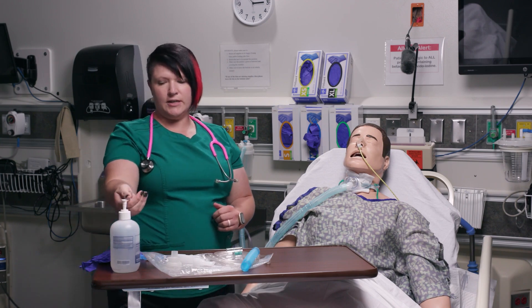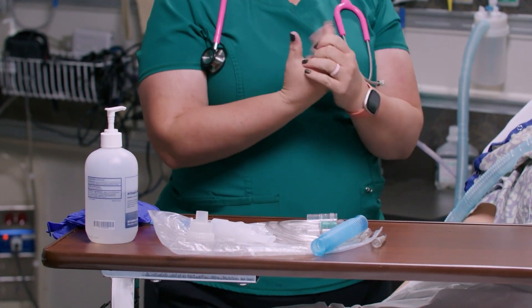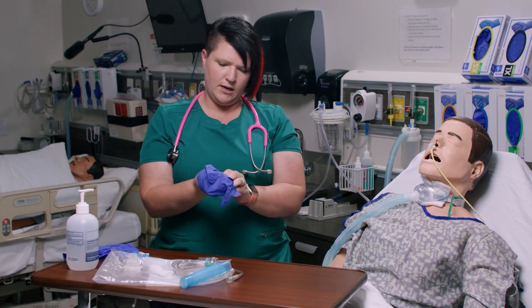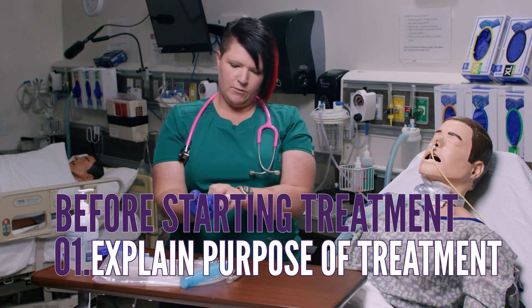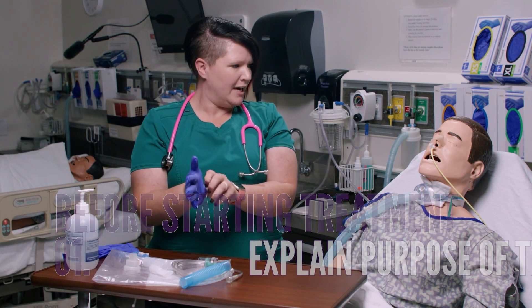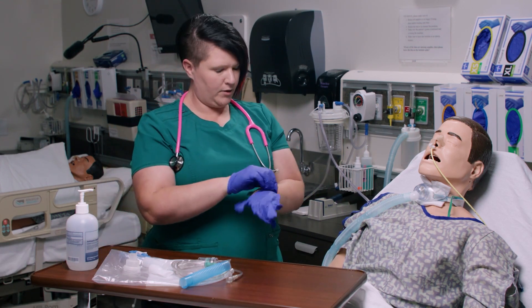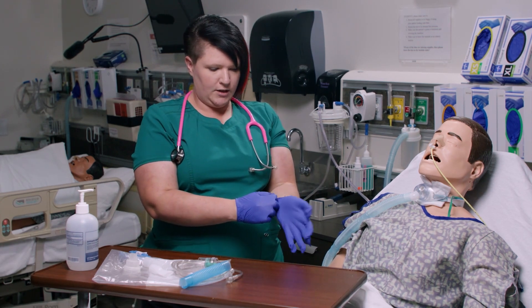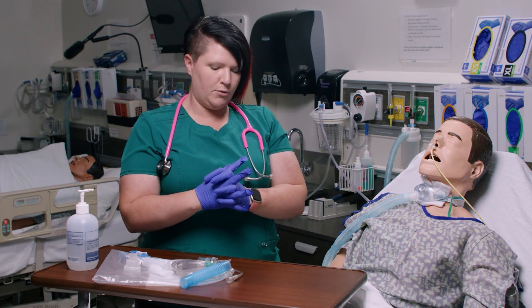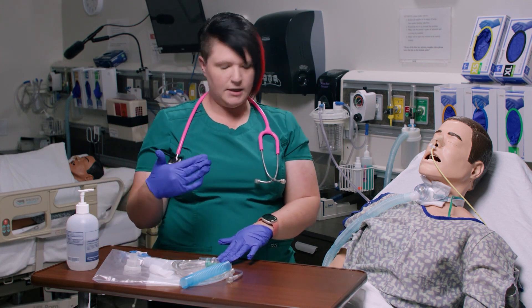Now I'm going to wash my hands and put on my gloves. As I'm doing this, I'm also going to educate the patient on why I'm in the room. Mr. Jones, I'm going to be administering a nebulizer medication for you. Your physician ordered it as needed for wheezing — you've been wheezing a bit, so we're going to give this to you to help. The nebulizer will be placed in your mouth, and I'll teach you more about how to inhale that medication as we get to that point.